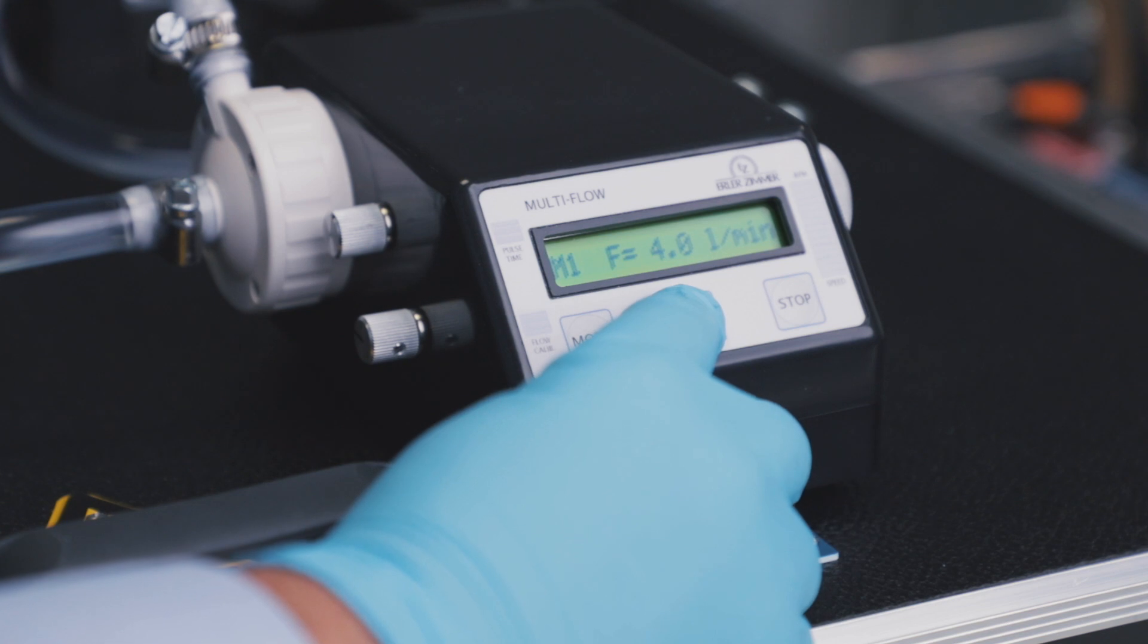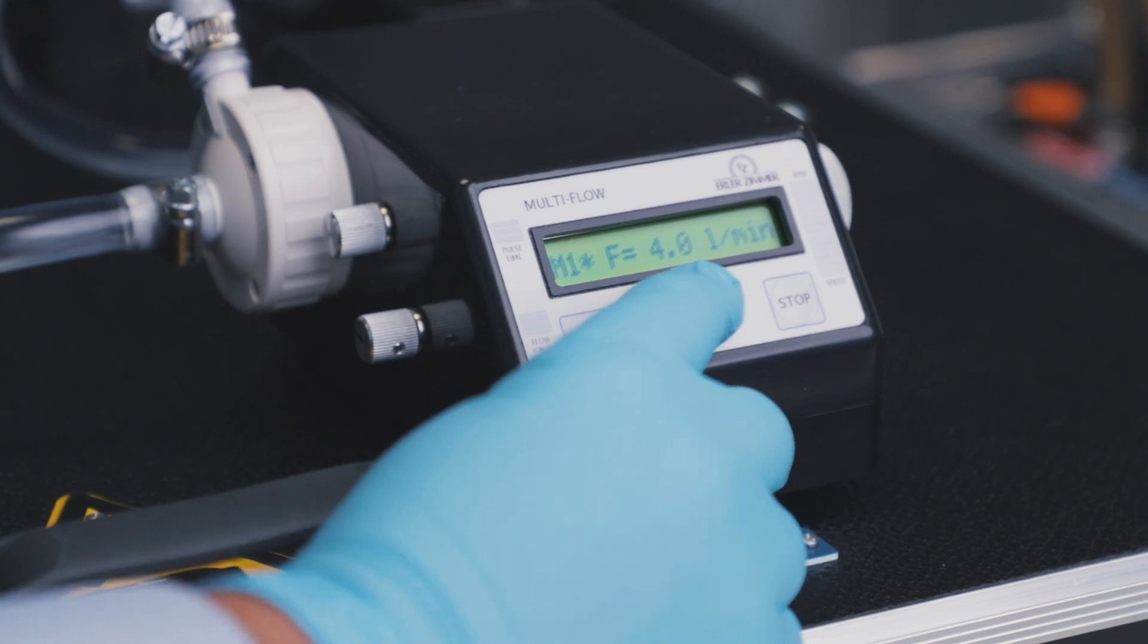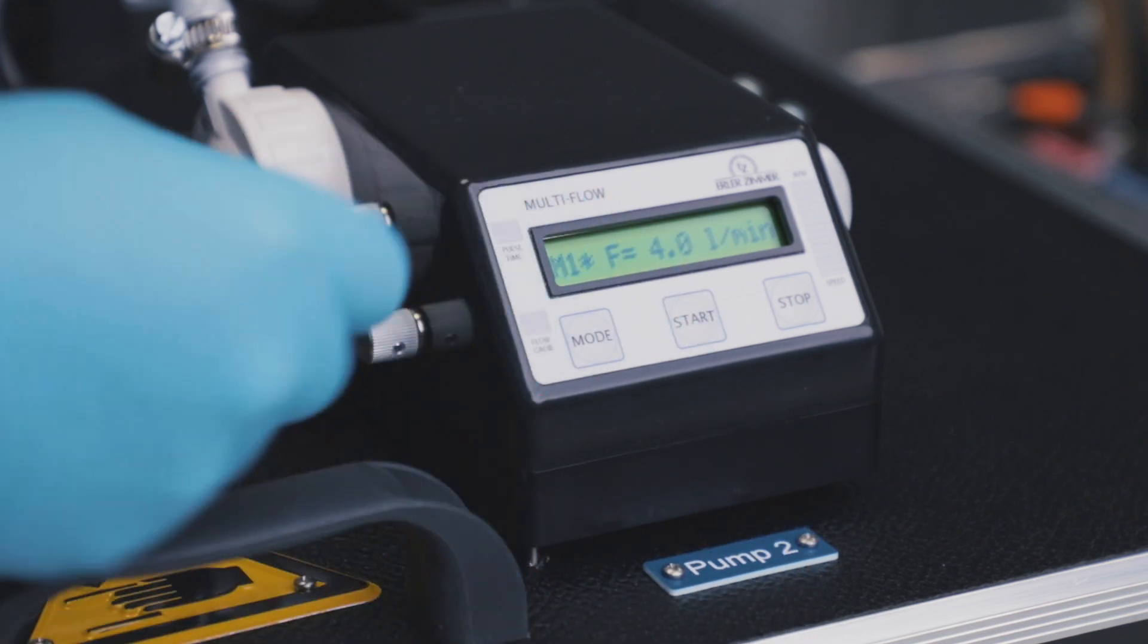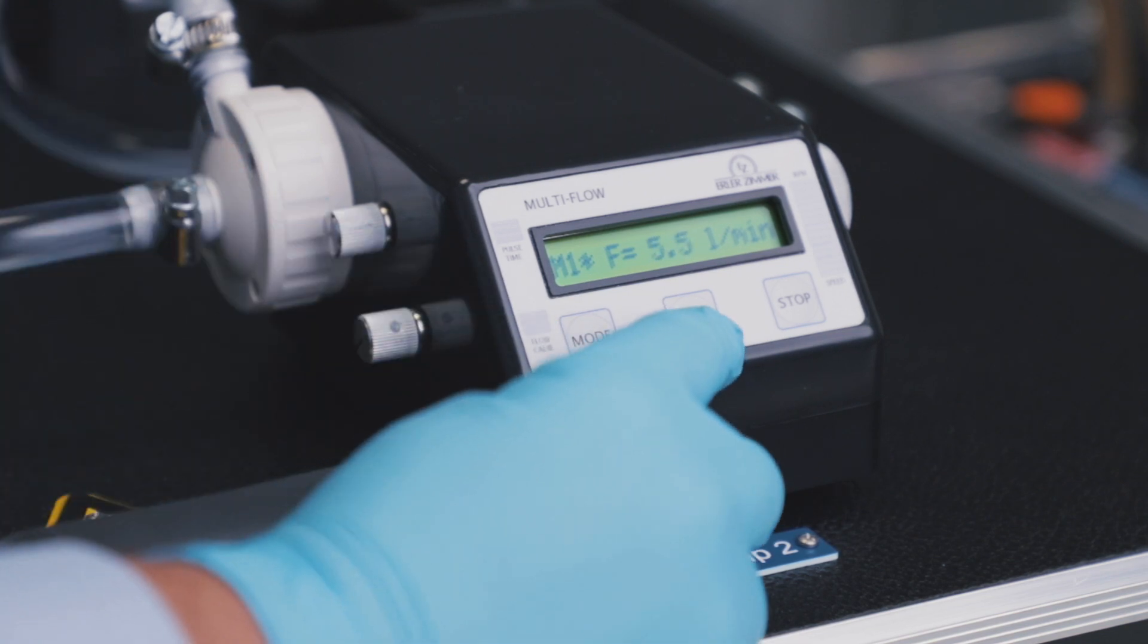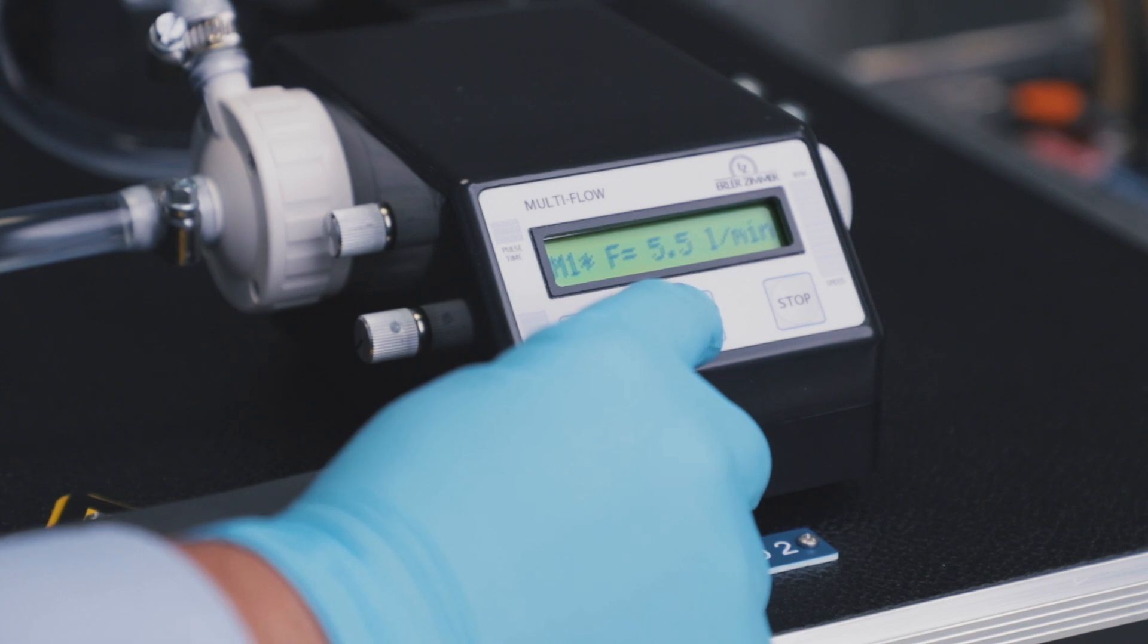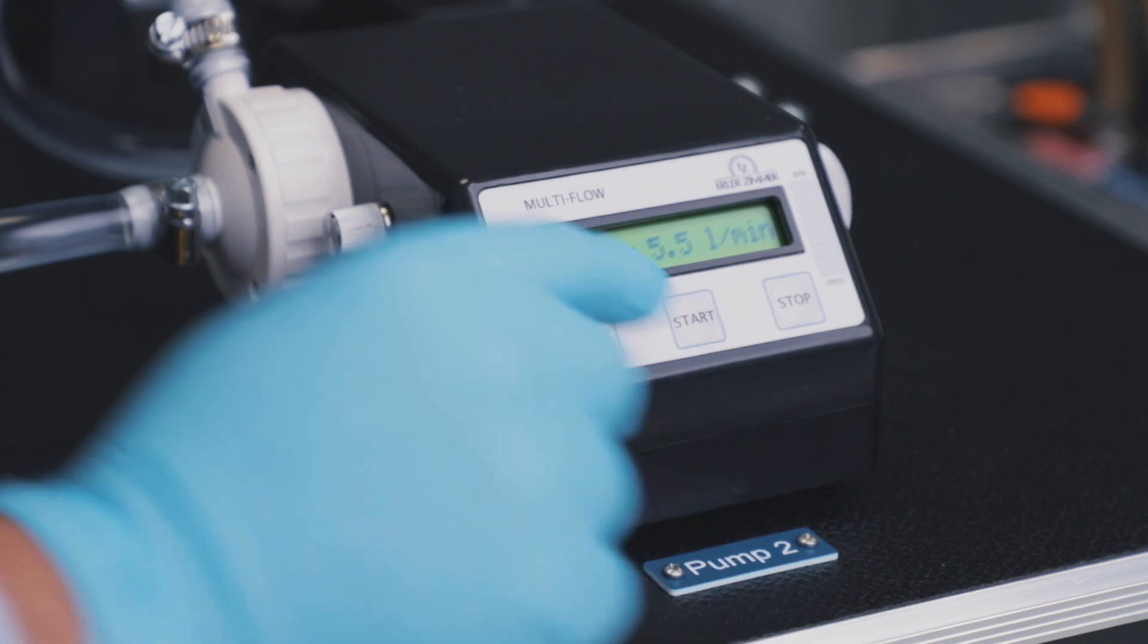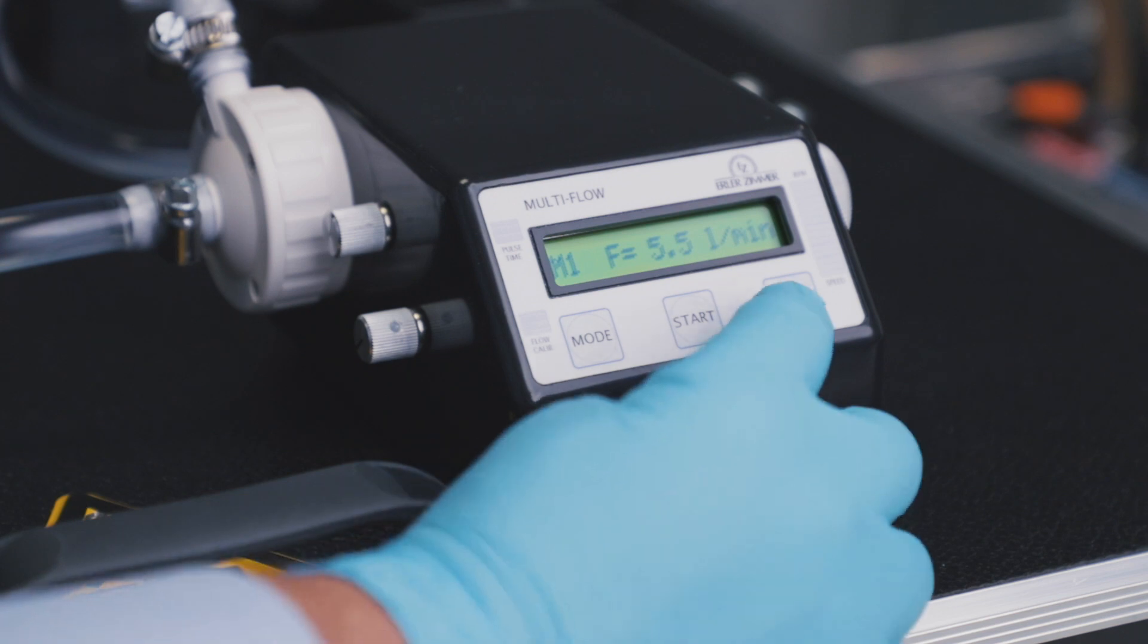If you press the start button for more than three seconds during operation, a small asterisk sign will appear. This means the pump volume display can be adjusted now by turning the lower small knob on the left. Adjust the volume to the value you see in your ECMO machine or any other flow meter.